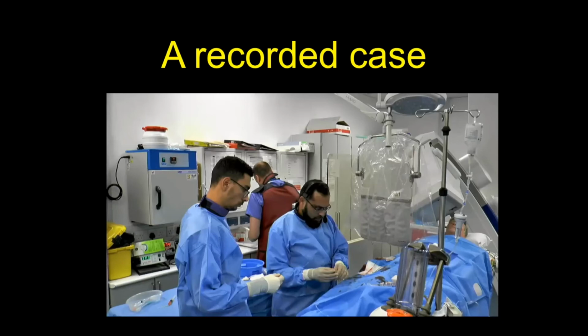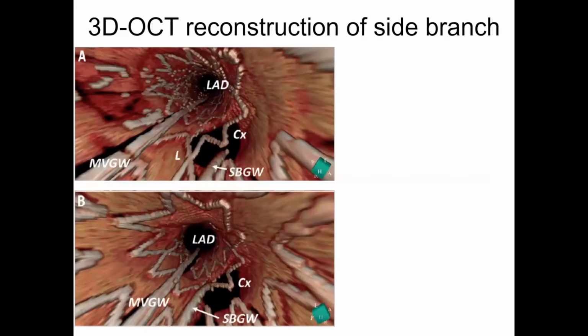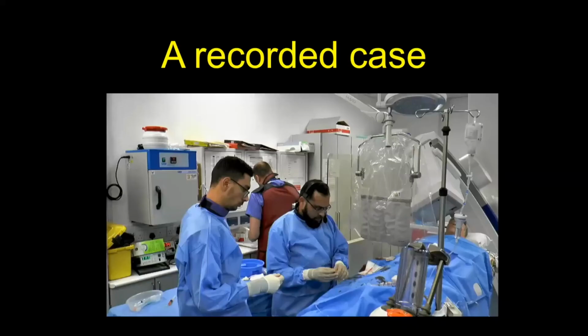Okay, fine. I will just miss that one. There is an interesting question on the chat box. Question: if you put a wire in the totally occluded LAD and the clot gets removed and there is a mild non-flow limiting plaque underneath, should we stent it or not? Again, if it's a normalish looking vessel, I don't stent it, because the stent for me is the treatment for a stenotic lesion, not for an eroded lesion.